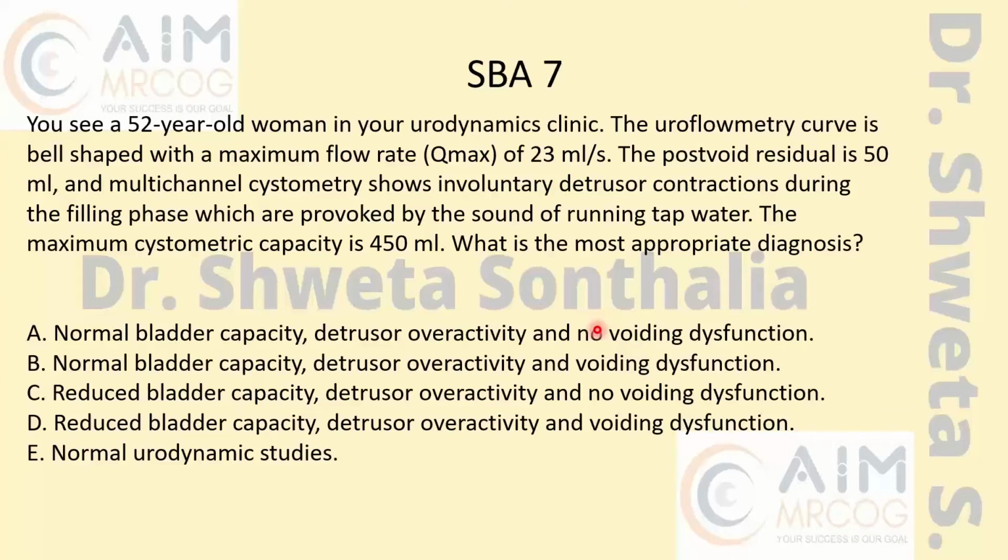Okay, so the uroflowmetric curve is bell-shaped. It is normal. Qmax is normal.